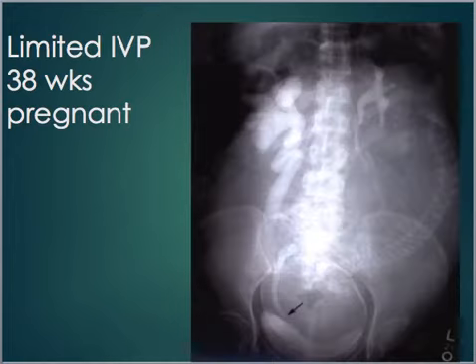I don't know if any of you can tell what's going on here. This is an IVP. We called it a limited IVP because we weren't able to get everything. I'm not sure if you can tell what this is. I know this picture's a little bit blurry, and I'm sorry, but I didn't even realize it was set up here. Sorry, I gave it away. This is a pregnant woman for her IVP. I guess I should take that off if I want to actually ask that question.